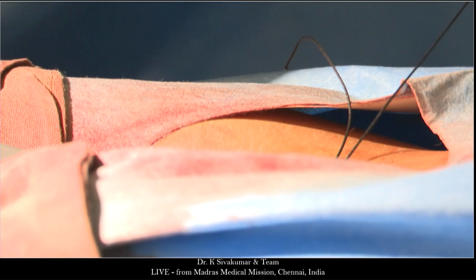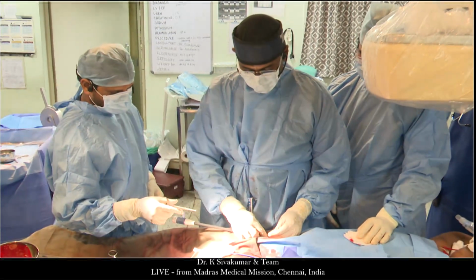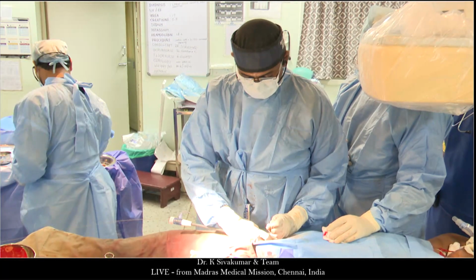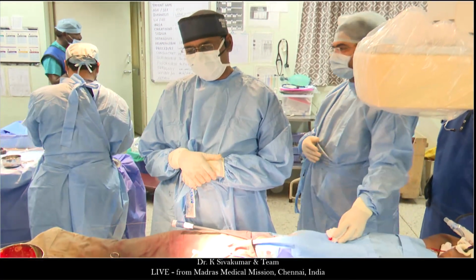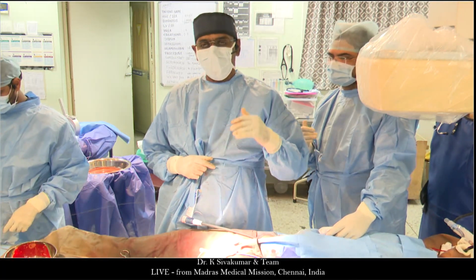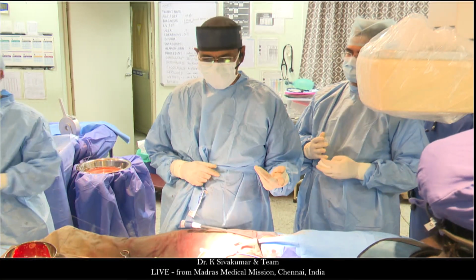But the definition of a caudal extension is this: if I have the transverse diameter of the superior cavoatrial junction compared to the vertical extent of the sinus venosus defect from the cavoatrial junction on a transesophageal echo, and the vertical extent is like 1.5 to 2 times the transverse diameter, then these patients are going to be difficult to close.